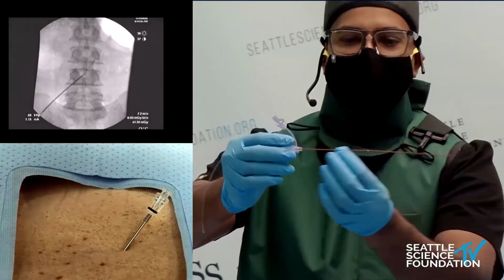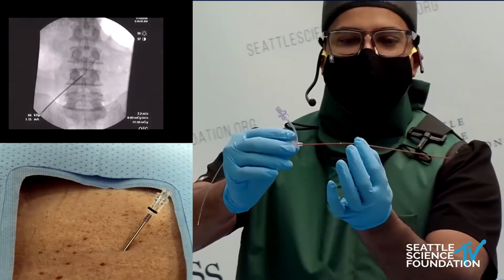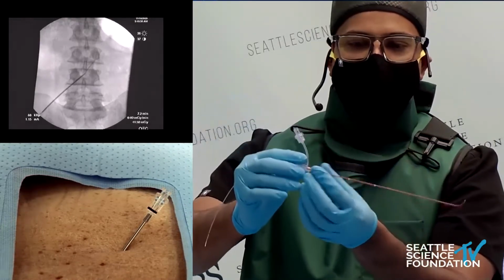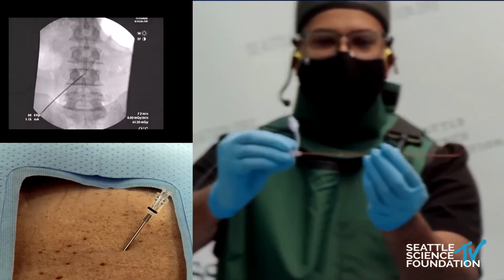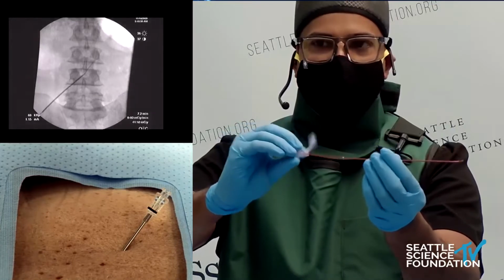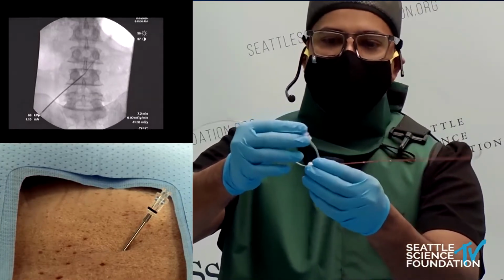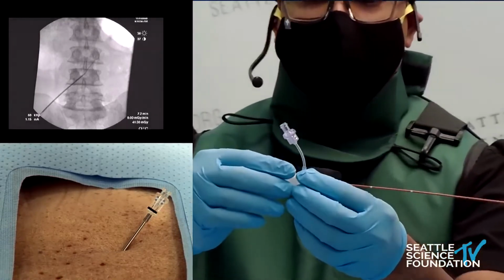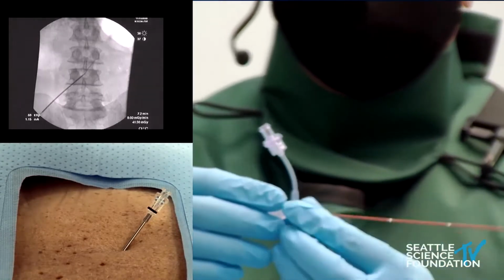So you'll have two different systems. Most of us end up using the large curve. The first dot here lets you know when you've entered into the epidural space, i.e. through the needle. You can see there's a flush port. And the flush port and the curve stay together. So everyone in the room knows what your curve is doing based on the orientation of the flush port. The flush port is actually rarely used to flush anything through. Every now and then I will inject a little saline just to reduce friction, especially in a fibrotic epidural space.